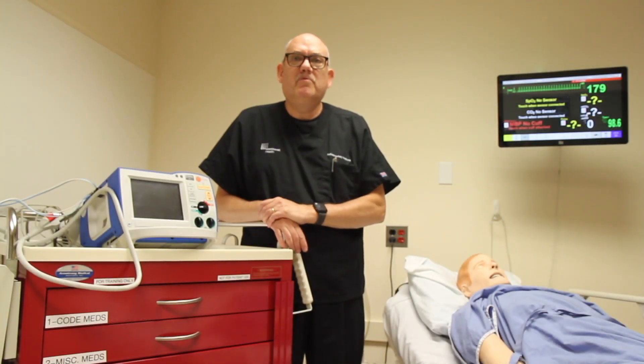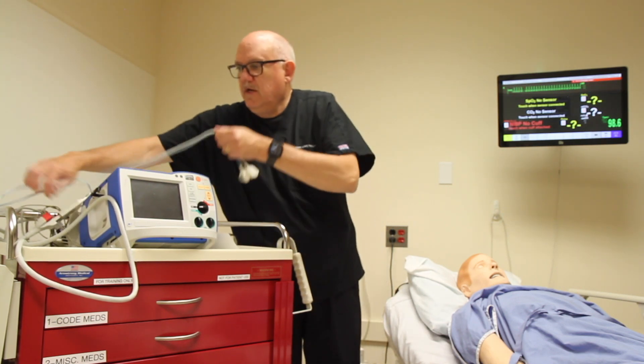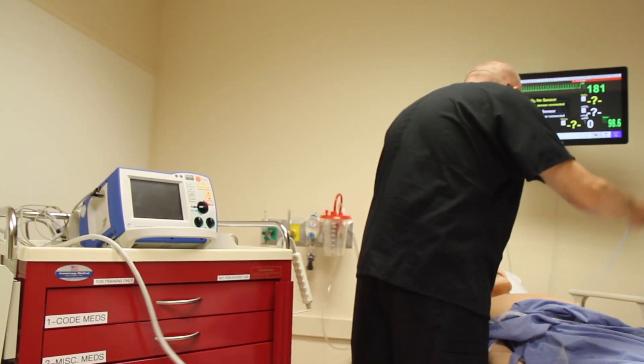In this module we will review how to perform synchronized cardioversion. As with defibrillation, the process begins by attaching the hands-free pads. Using the diagram on the pads package or the connector cables themselves, attach them to the patient's chest wall.